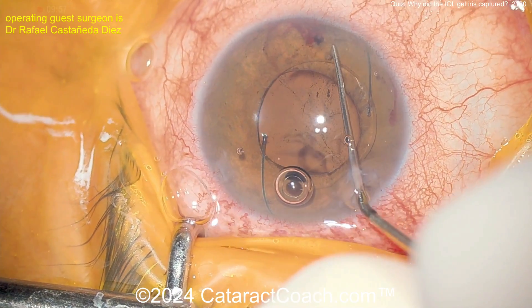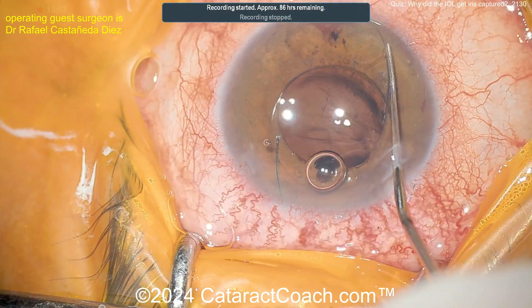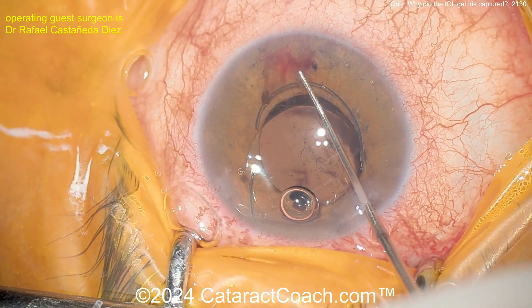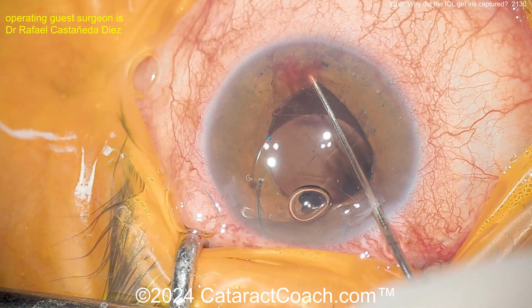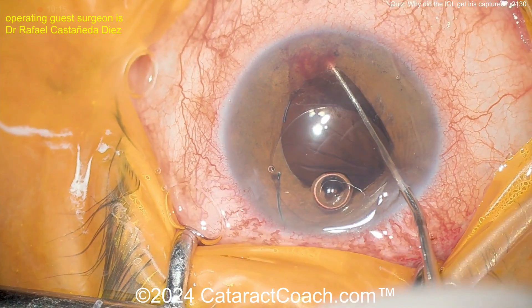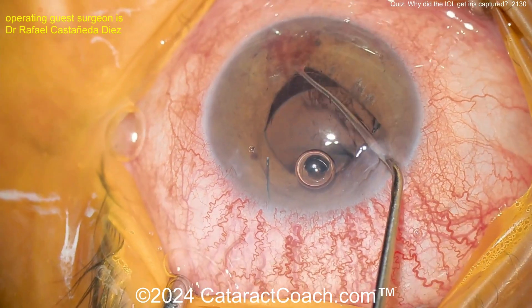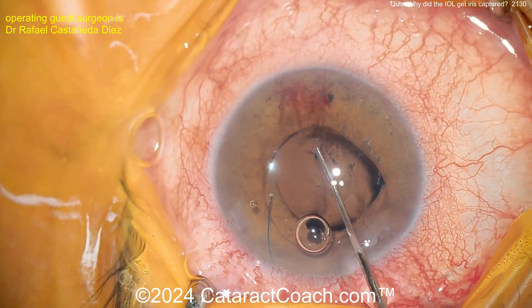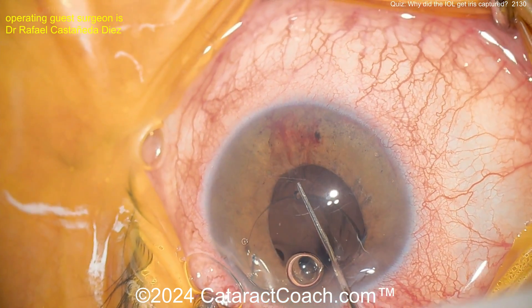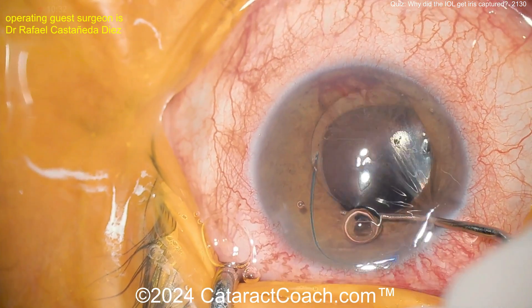The lens allows the optic to sit a little more posterior, a little farther away from the iris, so you won't have that same issue. That's the answer to the quiz. Go back and look at that title slide — you can tell it was upside down just from that title picture. The surgeon is now very carefully implanting the first haptic into the sulcus, nicely done, gently under the iris. Use that instrument to lift up the iris after placing the haptic to ensure good orientation and position.